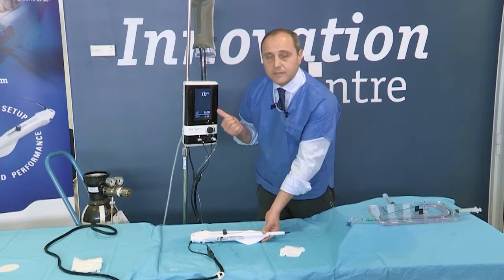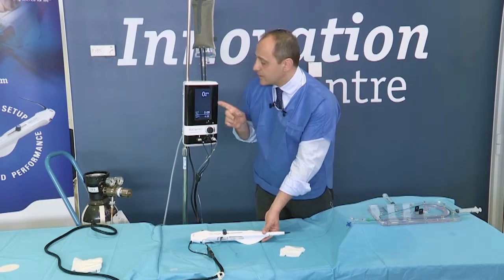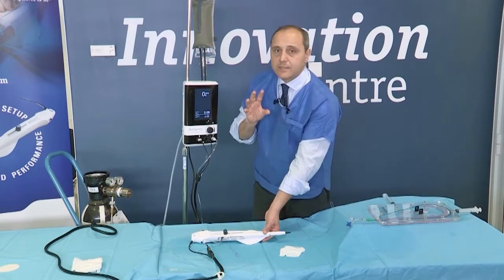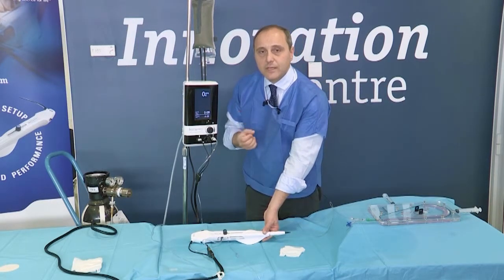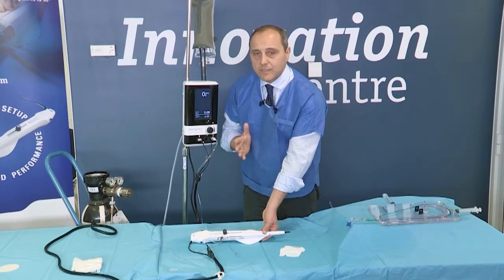As you have seen, there was a yellow triangle that popped up during my session. What was that signal? Actually, what you will see on this new version of the console are these colored feedback signals informing you on how much the speed of rotablation is decelerating. When this yellow triangle is empty, it means that the amount of deceleration is between 5,000 and 10,000 RPM.